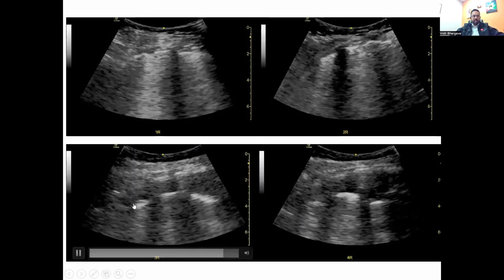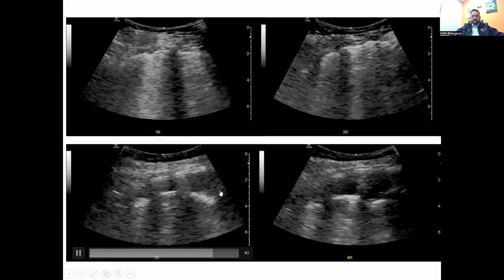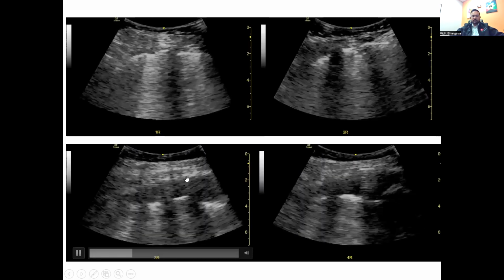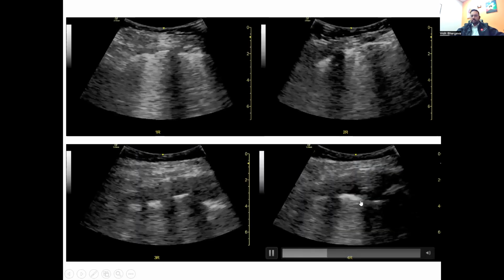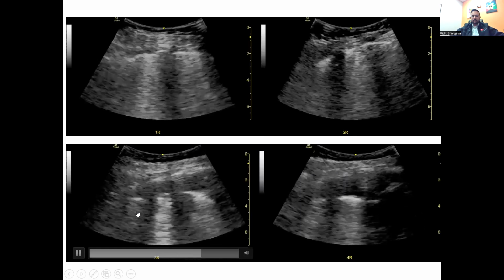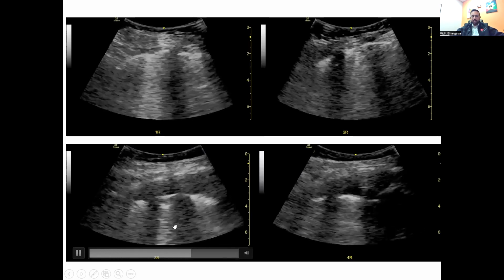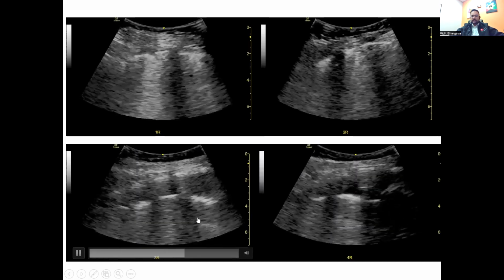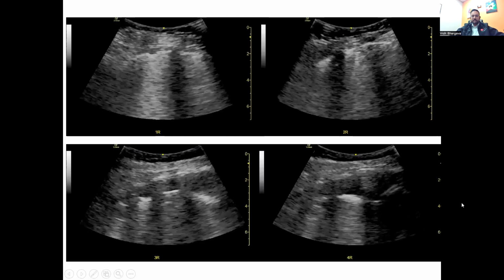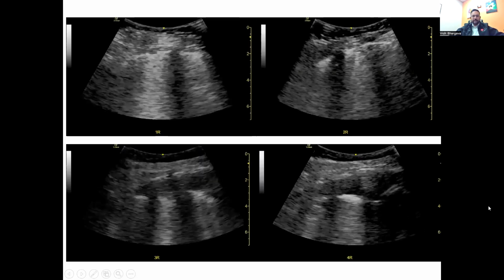And then if you look at the lateral lung fields, there is this anechoic fluid collection in between the pleura, which is consistent with pleural effusion on this side. There are also much more prominent B lines, and you see some air bronchograms underneath. So there's still a significant amount of disease burden, at least when you look at the lungs from a lateral approach.